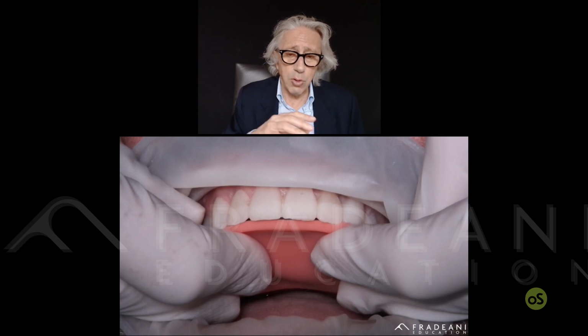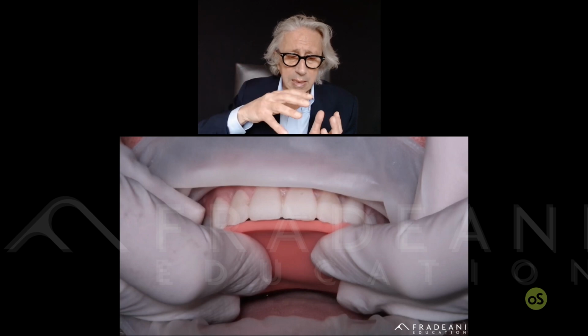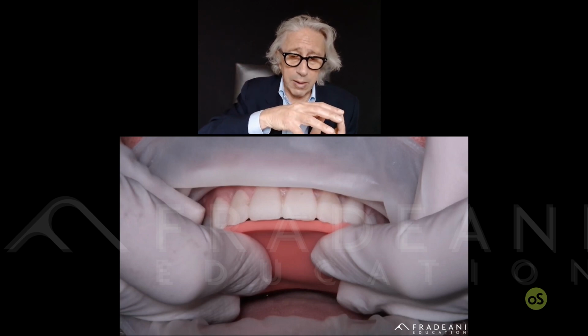But once you take two impressions, upper and lower, and you have to mount the two models without any help, you can find a perfect position, but you can also find a position that is a little bit not the same. It's exactly what happens when you take two initial models of a patient. Sometimes the occlusion is perfectly visible, but some cases are not perfect. So if you take the bite record anyway, you can be sure that the CR position in which the mock-up is will be reproduced also by the wax.